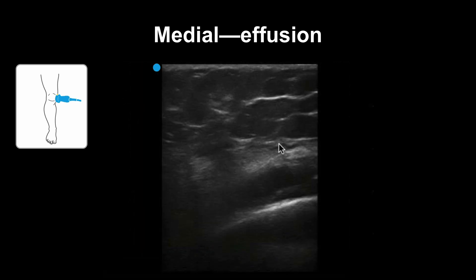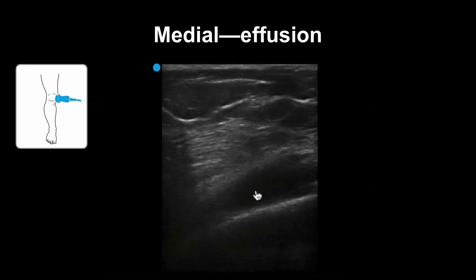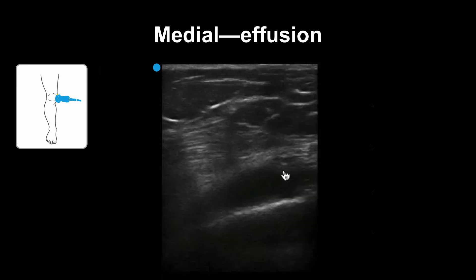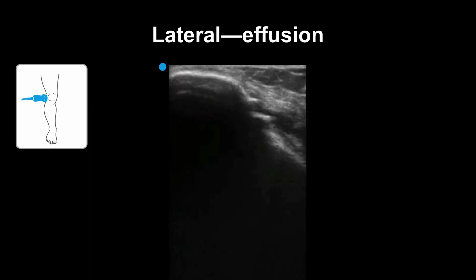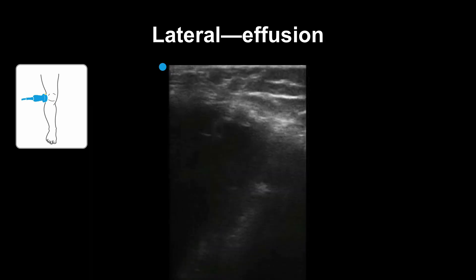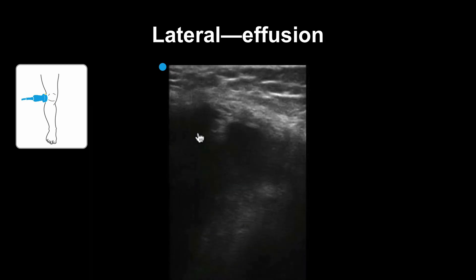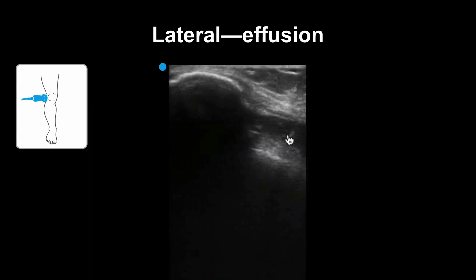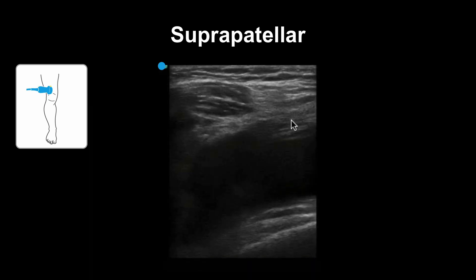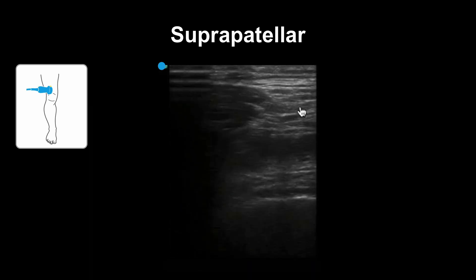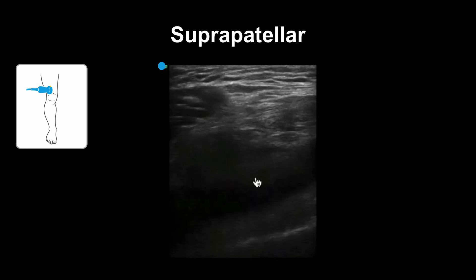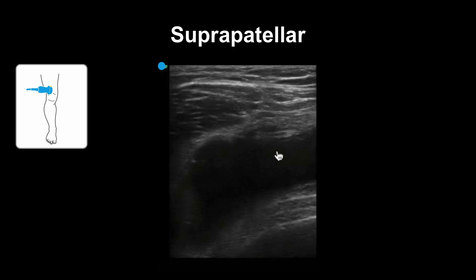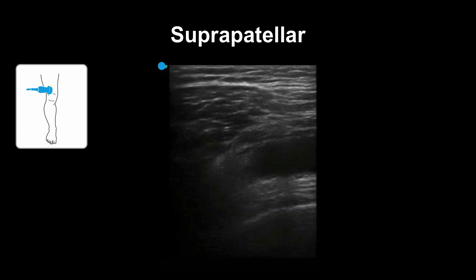Here is a smaller effusion via a medial approach. If you saw this pocket of fluid, you might look in other places to find a larger area to drain. Here is the lateral view on the same patient — there's really not much fluid to drain here either. Here is fluid in the suprapatellar space; see the hypoechoic region. This would be a good area to perform an arthrocentesis.